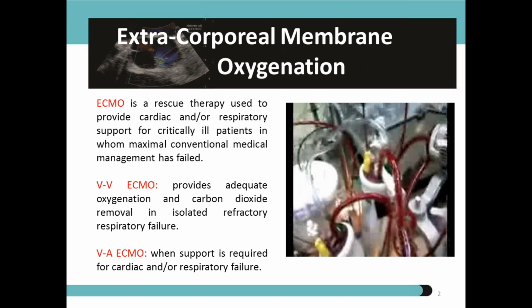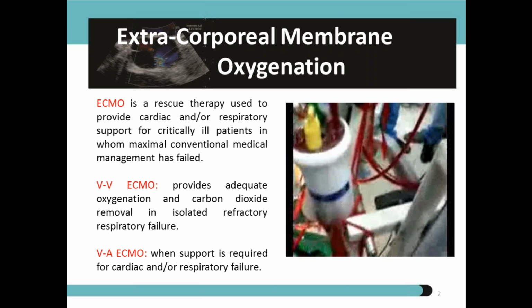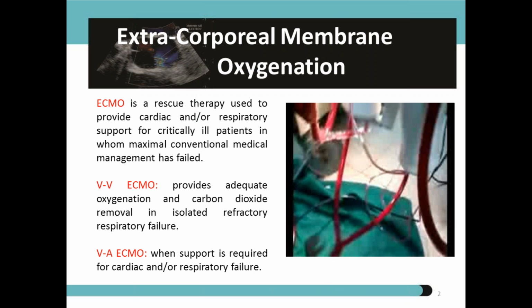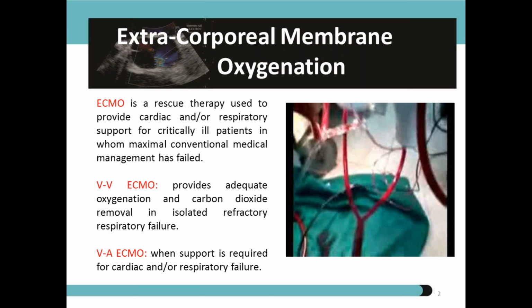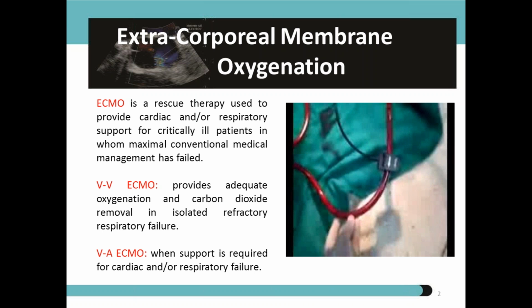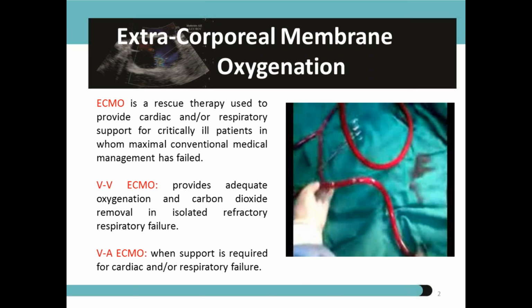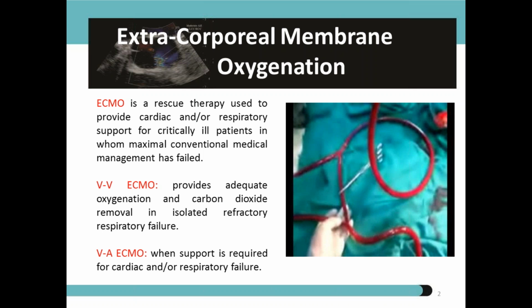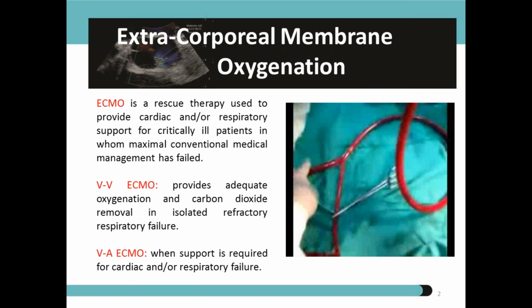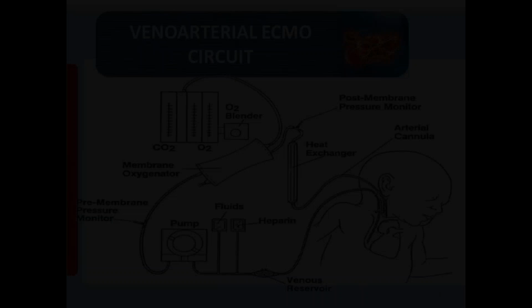So we started the concept of putting in a TE probe, a pediatric or a neonatal TE probe, because that gives a better window than a transthoracic probe, even with the swabs or the things on the patient's chest. And to our surprise, we found that blood clot is happening. Why? Because there is migration of the cannulas. This migration of the cannulas causes a left to right or a right to left shunt, and ECMO drainage decreases and ECMO fails. And within 5 to 8 to 10 hours or in 7 days' time, the patient starts bleeding and ECMO failure happens.